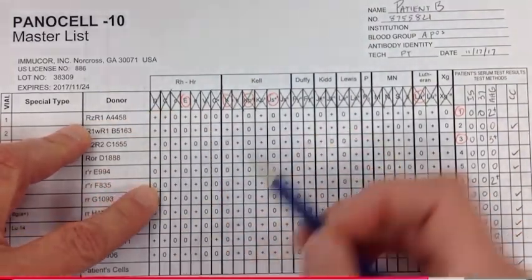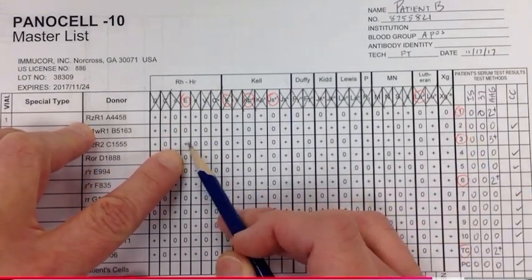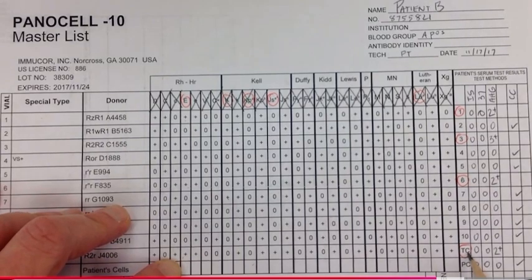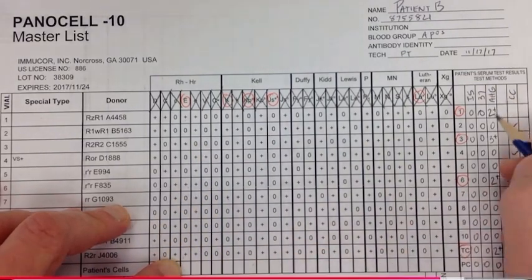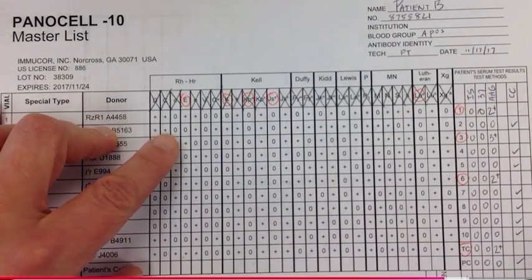All right, so that leaves us with big E and JSA. So let's see if that fits. So big E is positive in 1, 1, 3, 3, 6, 6, TC, TC. Okay, so I feel pretty good here about the pattern that I see, and besides that, big E is an IgG antibody, and all of our reactions are taking place at the AHG phase, which is suggesting that this is an IgG antibody.